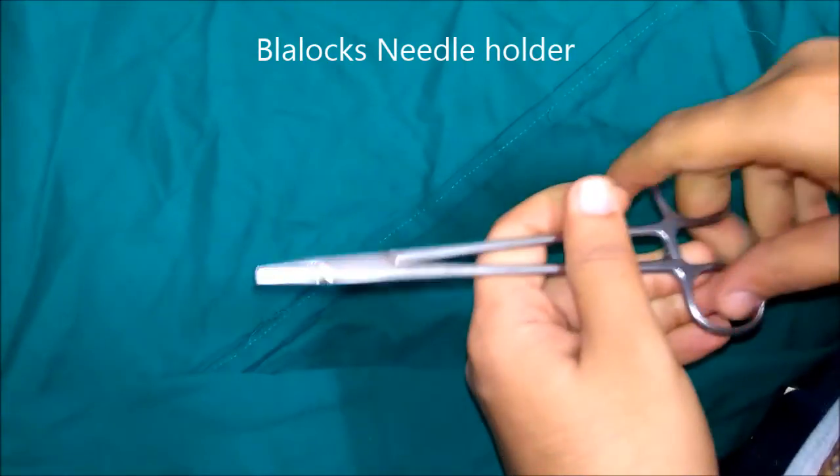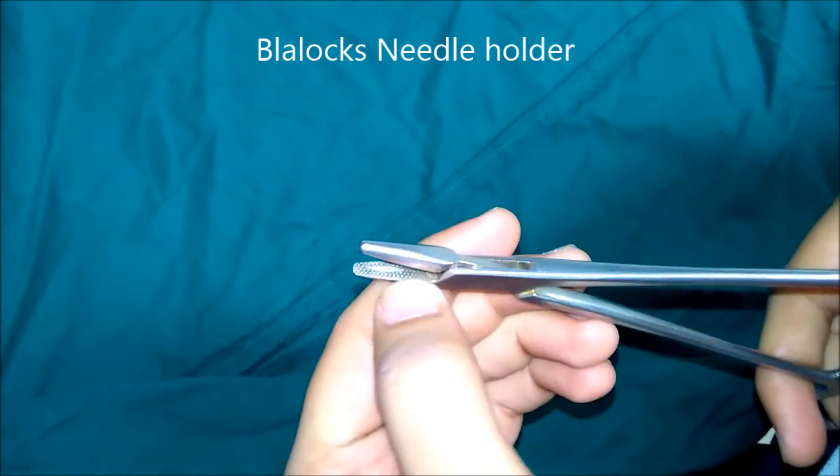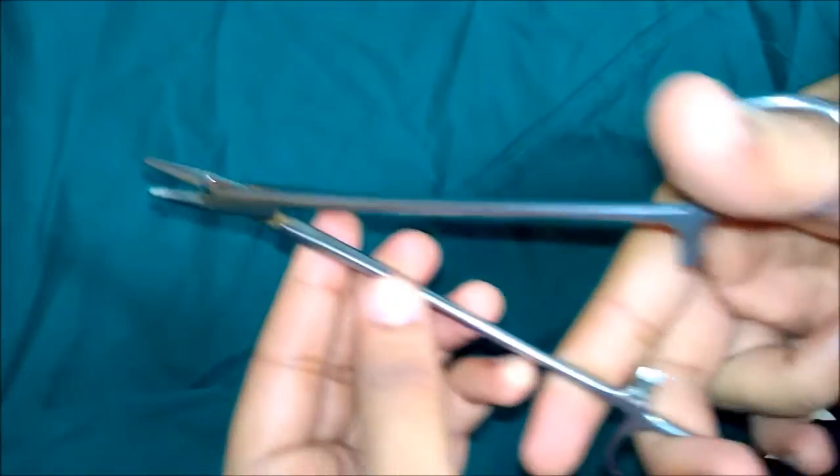This is Blalock needle holder. There are criss-cross serrations in the blade and a longitudinal groove in the center of the criss-cross serrations, which allows for firm gripping of the needle. The needle is usually held at the junction of the anterior two-thirds and the posterior one-third for ease of suturing.